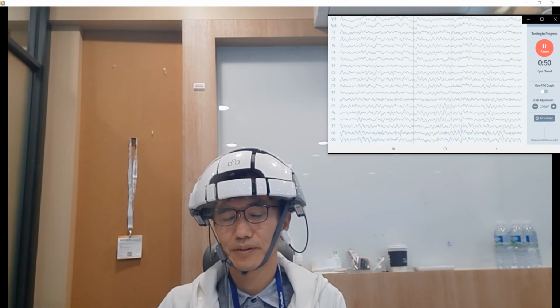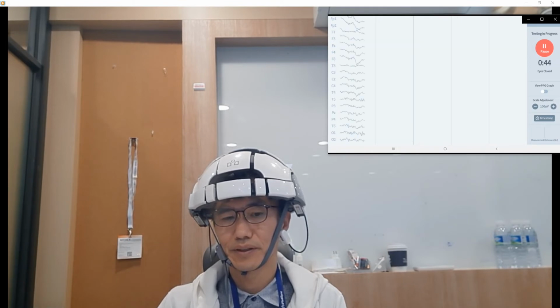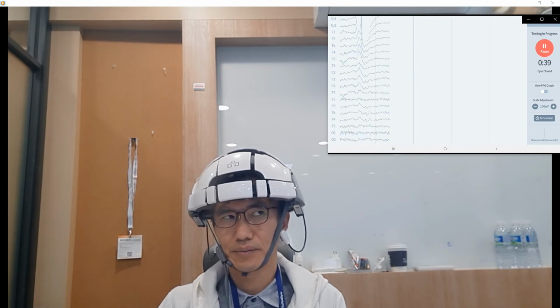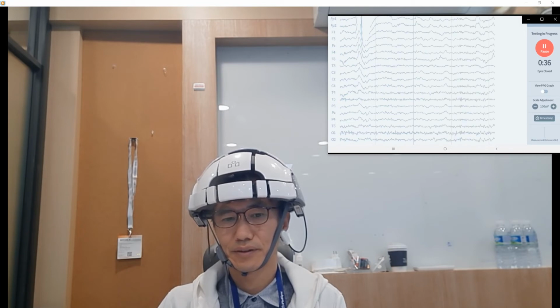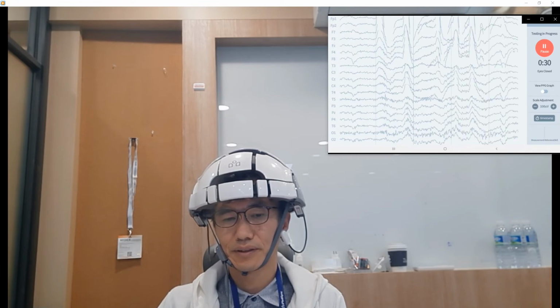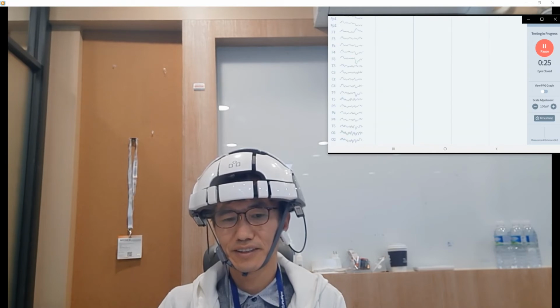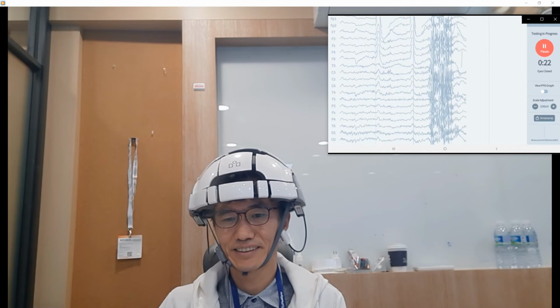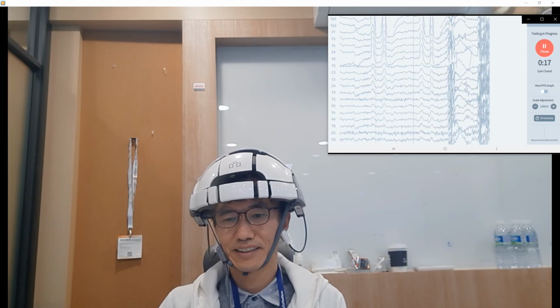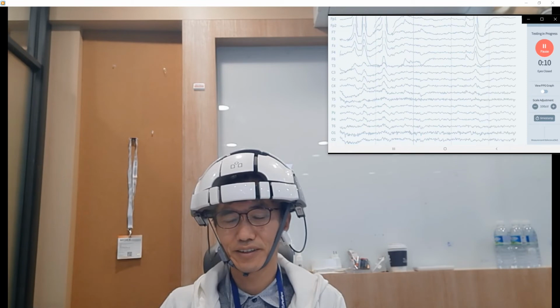And eyes open. Alpha activity disappears. And eye blinking, and horizontal eye movement. There is a noise, teeth grinding like this. Okay, this is the 2-minute eyes closed recording.